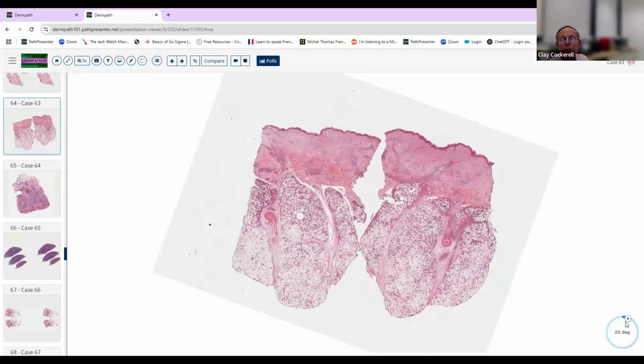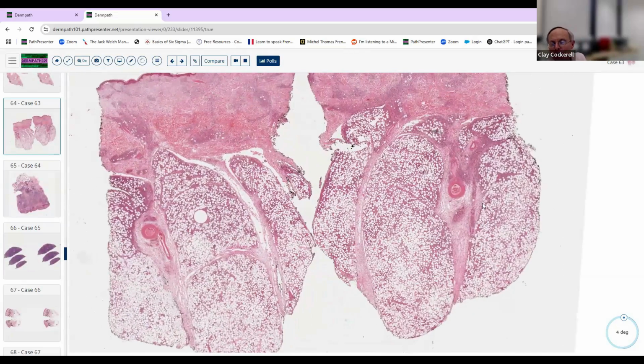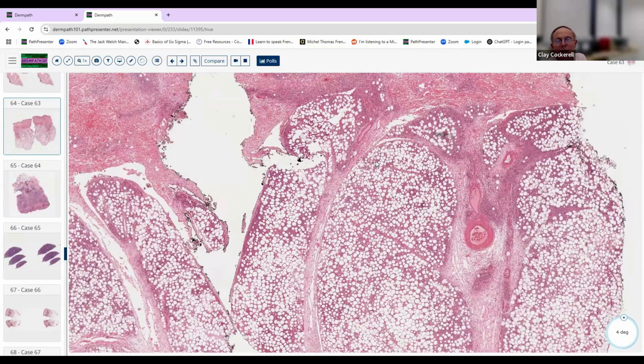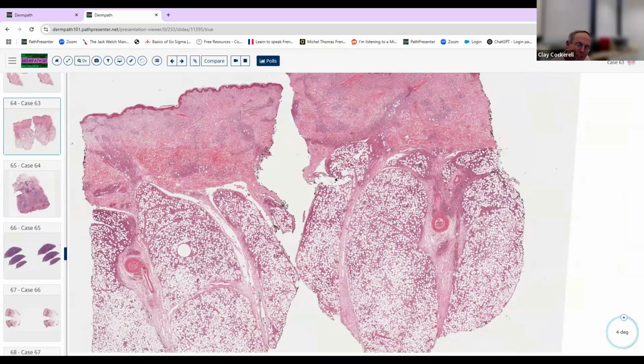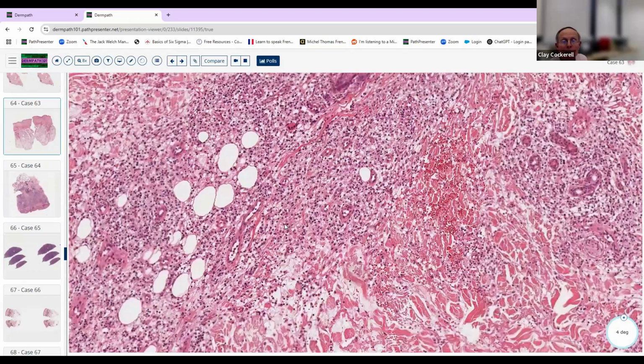Another example of a punch biopsy, very dense, very diffuse process involving the subcutaneous fat. And it's almost got kind of a diffuse honeycomb-like pattern, but it's not the DFSP. And then it's mostly a lobular panniculitis. So once again, lobular mostly, maybe septa involved here too, but this is 90% lobules, 10% septa. There might even be some involvement in the upper dermis up here too, okay?